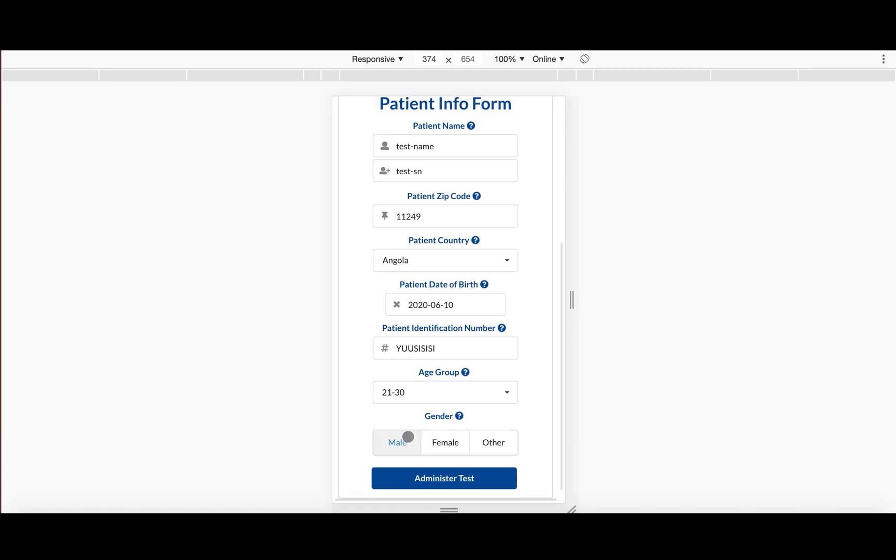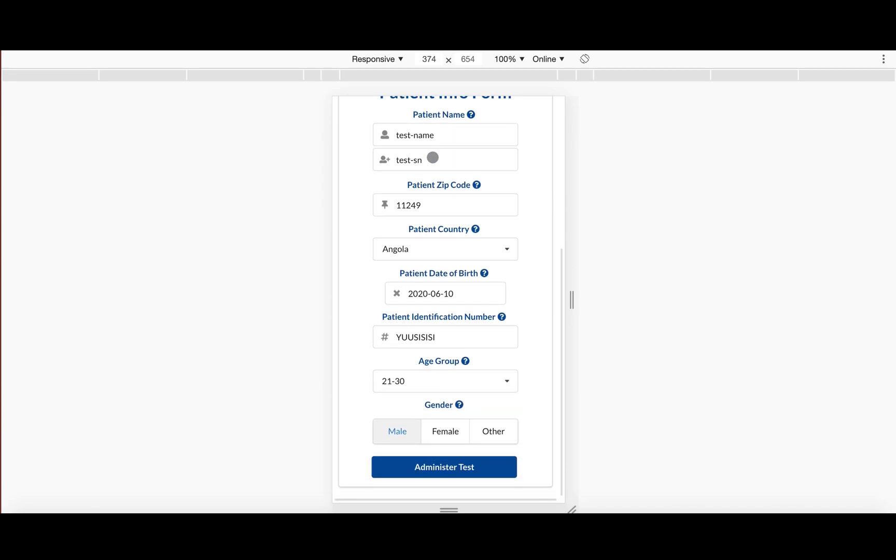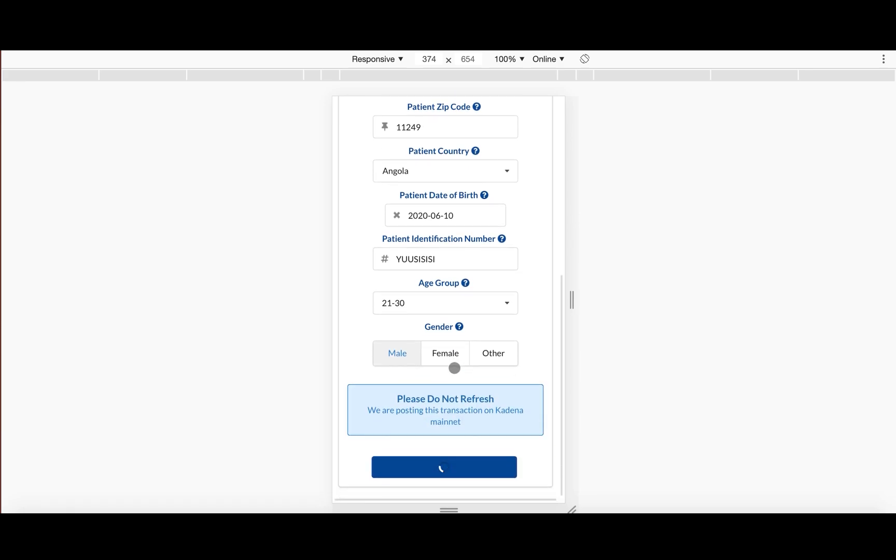So, and then what happens is once the doctor actually administers the test to the person, he fills out this form after having scanned the QR code and presses administer test.